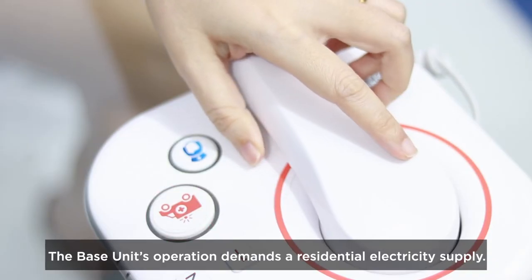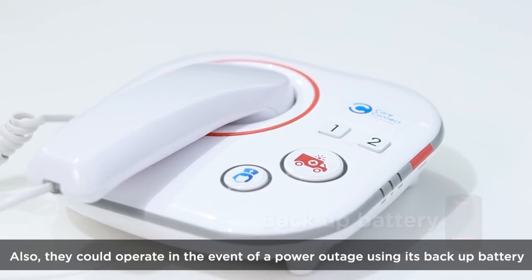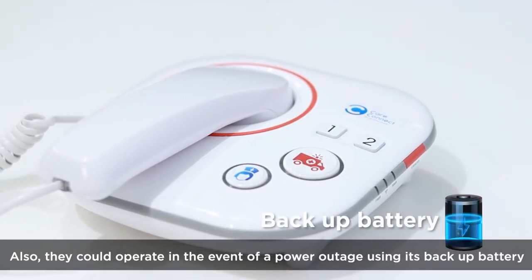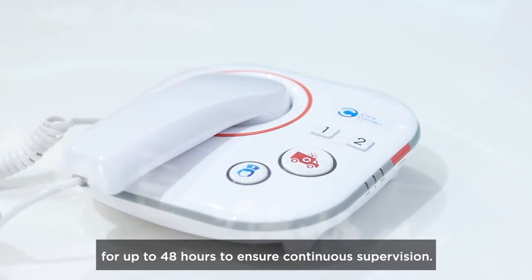The base unit's operation demands a residential electricity supply. Also, it can operate in the event of a power outage using its backup battery for up to 48 hours to ensure continuous supervision.